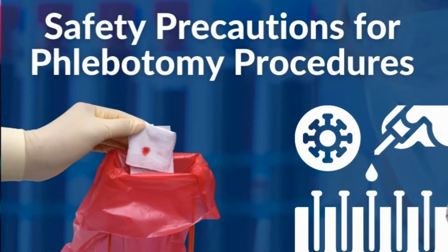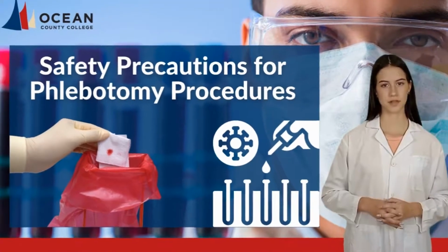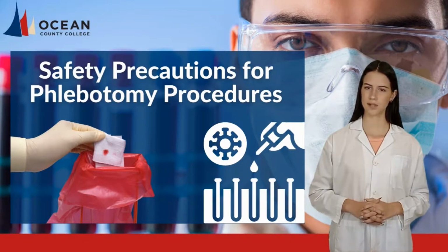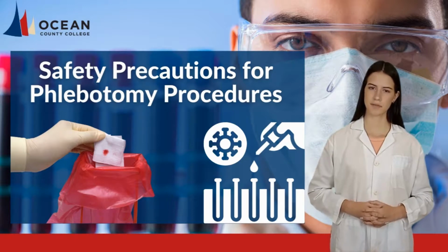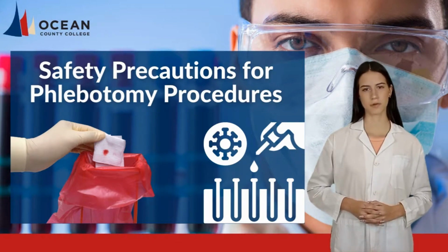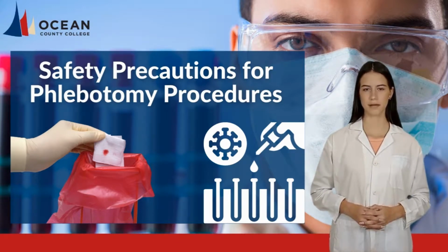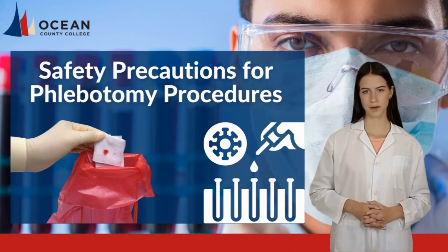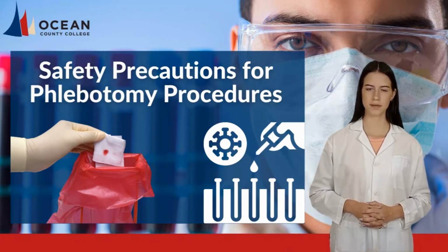Safety is a paramount concern in the healthcare workplace. The phlebotomist must pay close attention to workplace safety and learn the most effective ways to avoid hazards such as biologic, physical, sharps, chemical, radioactive, electrical, and fire dangers. Most important of all is the danger of accidental contamination with blood or other body fluids. In addition to specific safety precautions for phlebotomy procedures, a number of general precautions can reduce your risk of injury.